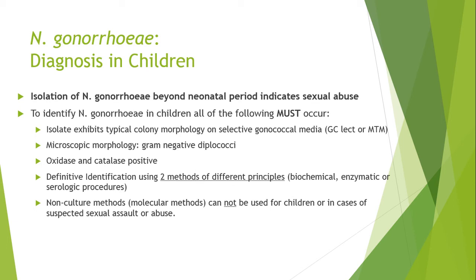So your chromogenic substrate assay and carbohydrate fermentation. That would be two different methods based on two different principles that you can use to confirm that it's gonorrhea. And then you cannot use non-culture methods like molecular methods in children.